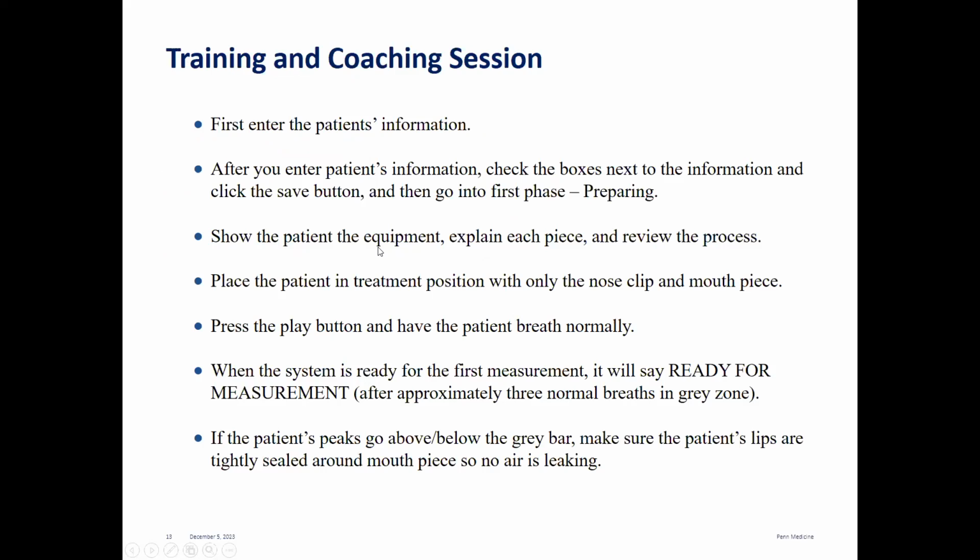So for training and coaching during the session, you're going to first enter the patient's information. Once you enter that information, there'll be little check boxes that appear next to it, so you'll check them all off. You'll click save. Then you'll go to the first phase, which is preparing. You're going to show the patient all the equipment and explain each piece and review the whole process of what they can expect during this.